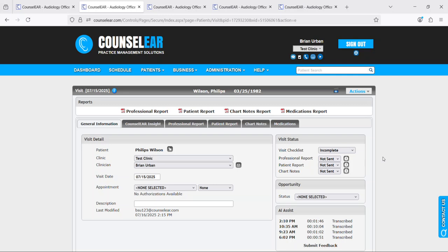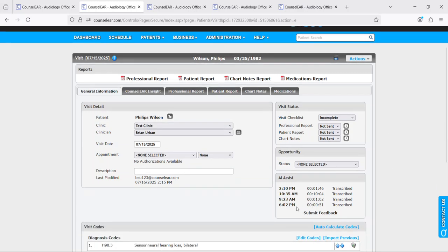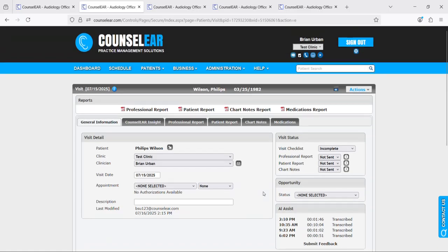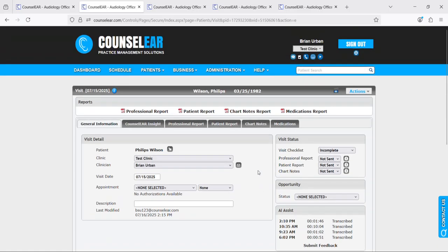So that's the process for utilizing the Counselor AI Assist feature within a patient visit. One quick note here is that you can have multiple sessions within the same patient visit. Typically you'll just have one, but if you find a need to start a session, maybe stop it at some point and then start another one later on, you absolutely can do that.